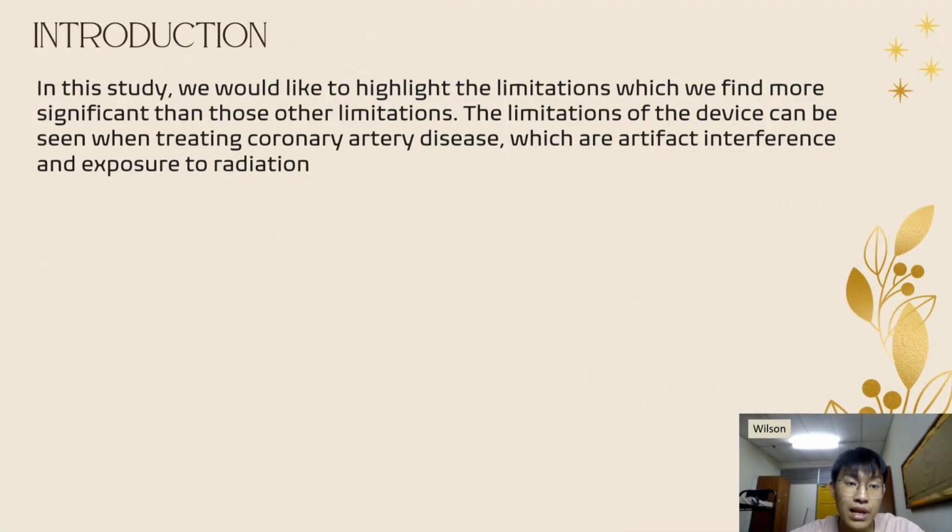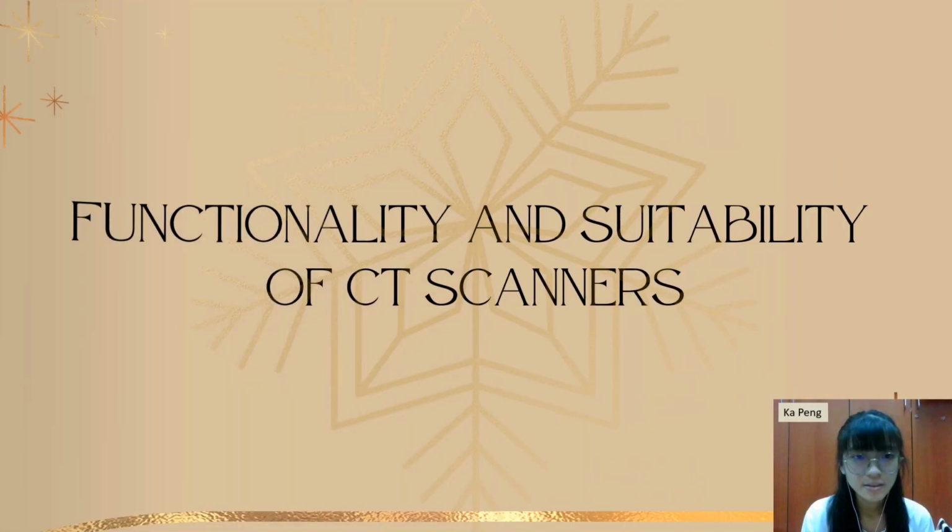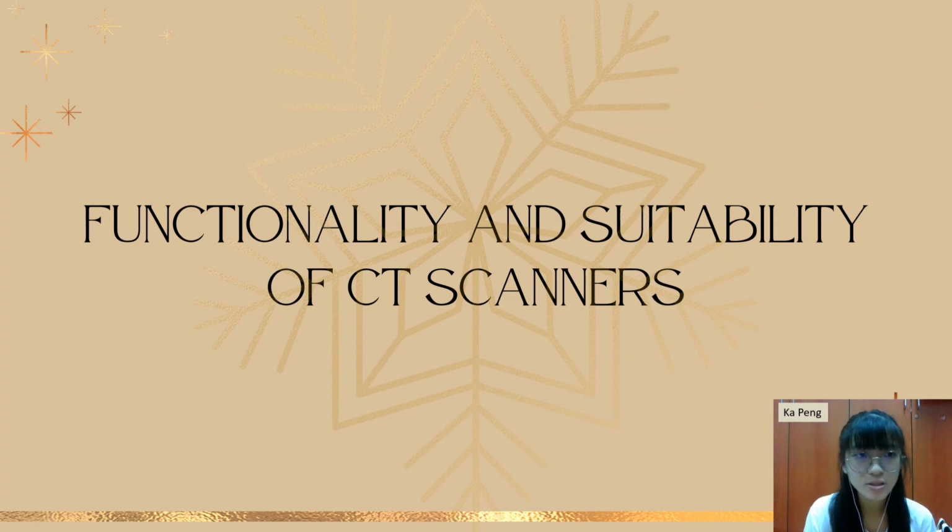In this study, we would like to highlight the limitations which we find more significant than the other limitations. The limitations of the device can be seen when treating coronary artery diseases, which are the artifact interference and exposure to radiation. Next, we move to the functionality and suitability of CT scanners.